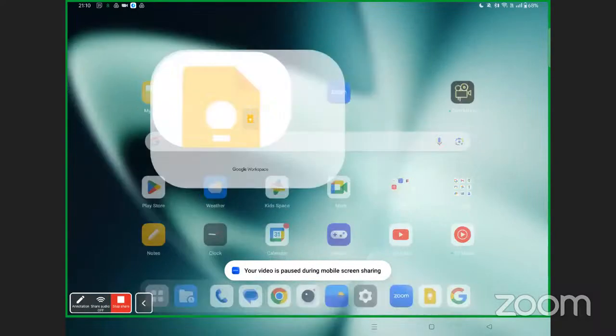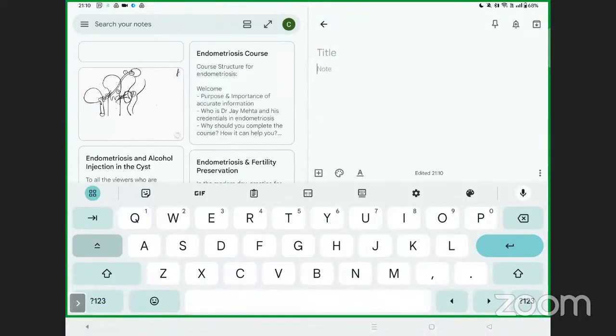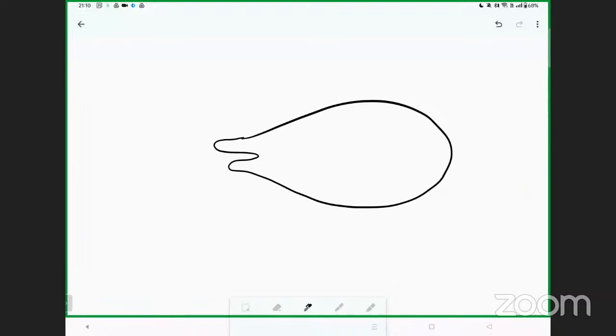Okay, so hi guys, I'll switch straight to the screen sharing. It is important that we understand what we should keep in mind predominantly whenever we talk of embryo transfers. We have a uterus like this, which is a normally mid-positioned uterus, and a partially filled bladder over it.